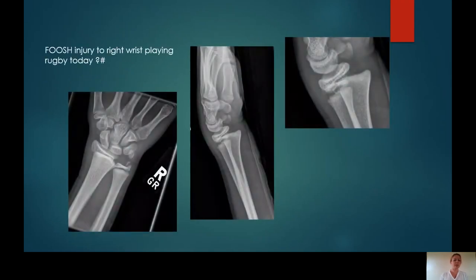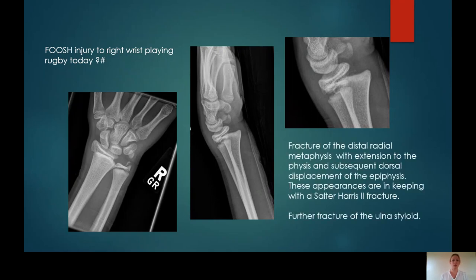Case 4: FOOSH injury to right wrist playing rugby, query fracture. There's a fracture of the distal radial metaphysis that extends into the physis — in keeping with a Salter-Harris type 2 fracture. On the zoomed lateral projection, there is disruption of the distal radial dorsal metaphysis, and tiny little fracture fragments adjacent to that metaphyseal surface. There is also a further fracture of the ulnar styloid.